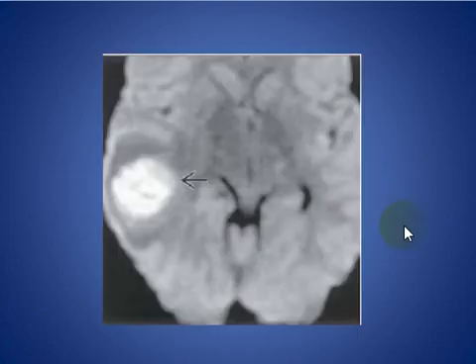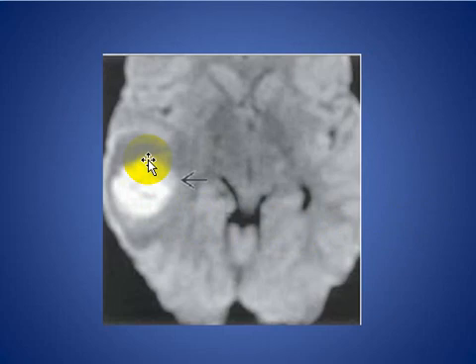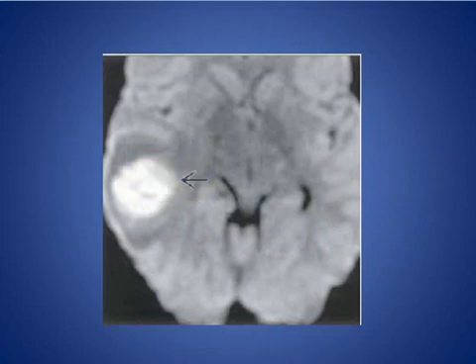Here is another patient with diffusion-weighted MRI demonstrating restricted diffusion in a mass lesion due to pyogenic abscess.